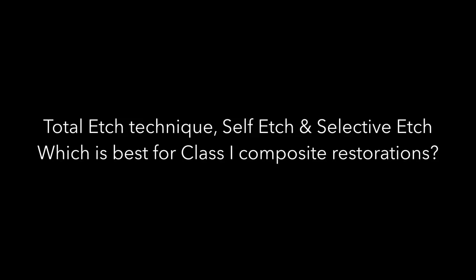Please add, Dr. Kashif, something. 6th generation is also self etching, in which the primer itself is acidic, so we don't need any separate etchant in the 6th generation. So it's advisable that whenever we are dealing with dentin, we should use the self etch method rather than total etch. Otherwise, with total etch, when we dry the surface, the collagen will collapse. And the total etch system also removes all the smear plug completely, which leads to post-op sensitivity. Yes.